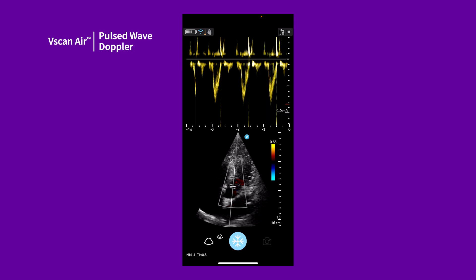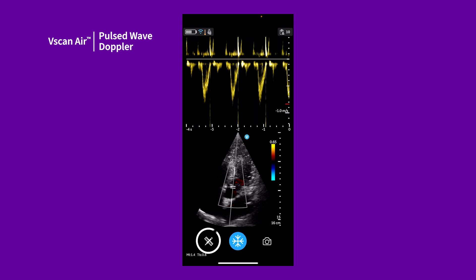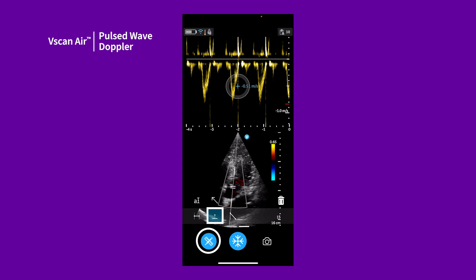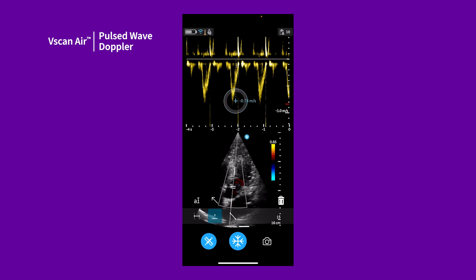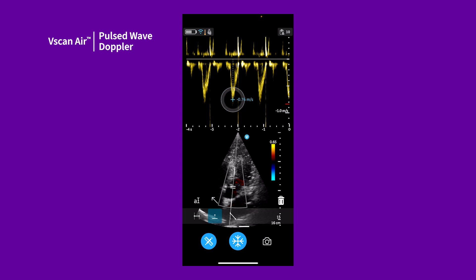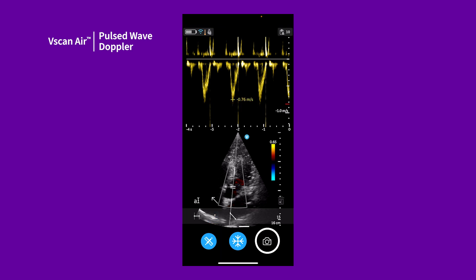On a frozen image, tap the measure icon. Let's take a velocity measurement. Simply position the caliper on the Doppler signal and the system will display the velocity measurement. Tap the store icon to save.